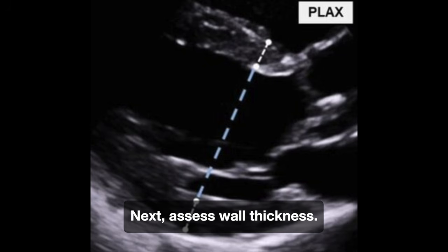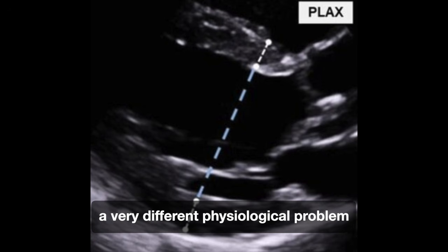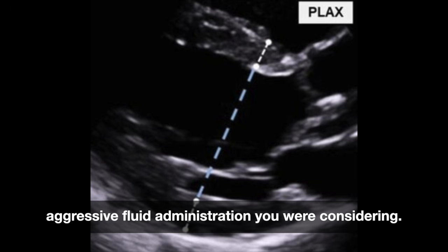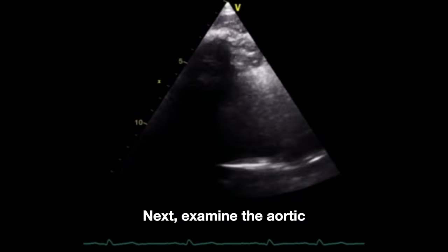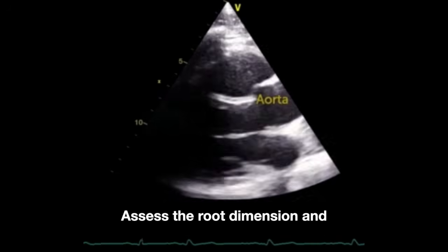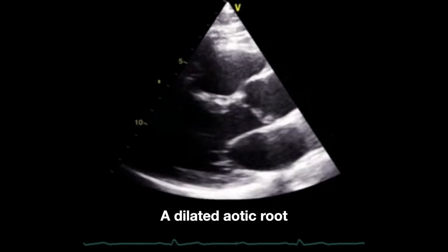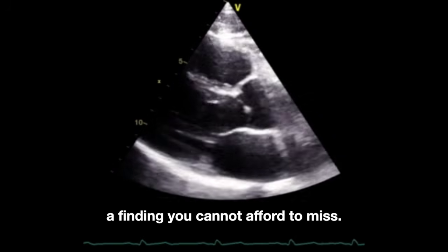Next, assess wall thickness. A thick interventricular septum in a hypotensive patient represents a very different physiological problem from a thin septum. It may indicate a chronically hypertensive heart with impaired filling that may not tolerate the aggressive fluid administration you were considering. Next, examine the aortic root and aortic valve. Assess the root dimension and determine whether the valve is opening adequately. A dilated aortic root in the appropriate clinical context is a finding you cannot afford to miss.